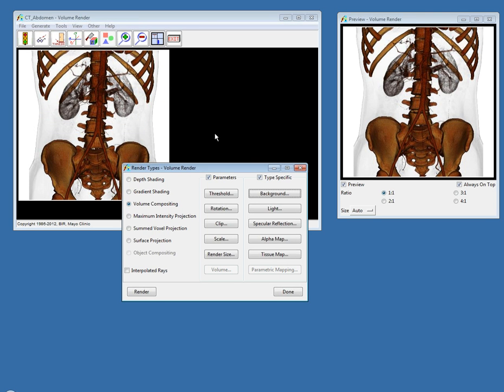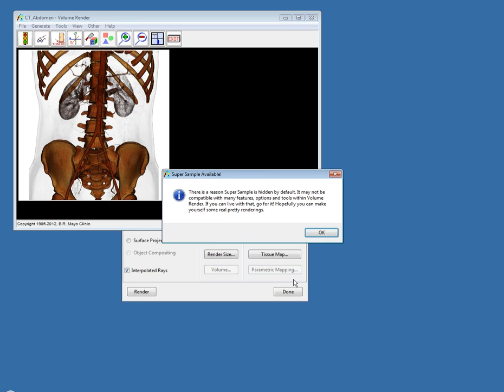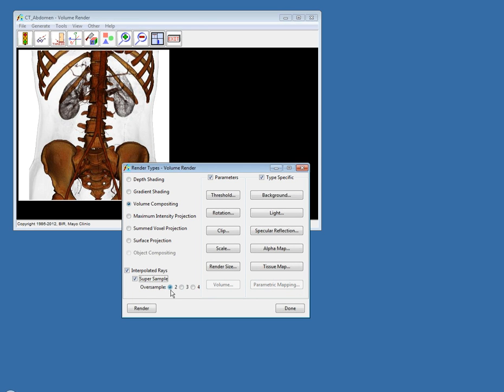The next option for creating visually enhanced renderings is called Supersampling. With Supersampling, a ray is cast through every pixel in the rendering, creating a higher resolution or high-definition rendering. This takes a little longer to render, so I'll close my preview window first. To access Supersampling, you first need to turn on Interpolated Rays. In the final release of Analyze 11.0 on May 31st this will be easier to access. For now I'll press Control-Alt-Shift-S to get the Supersample checkbox, choose to oversample by 2 rays, and hit Render.